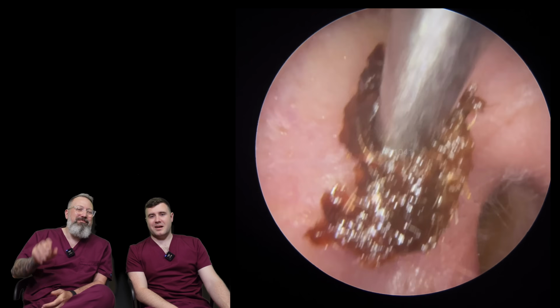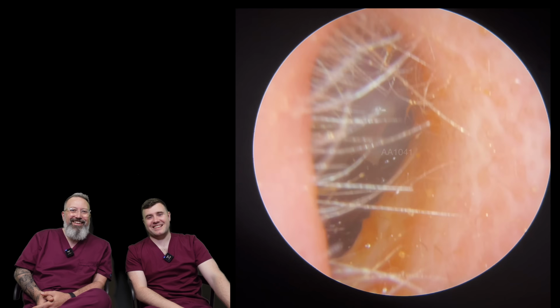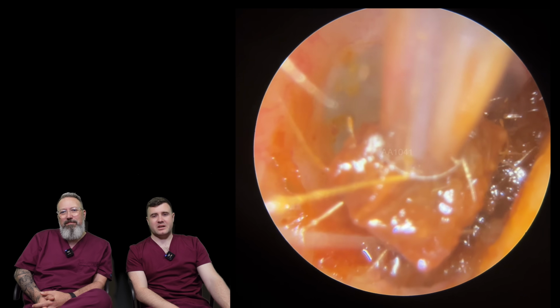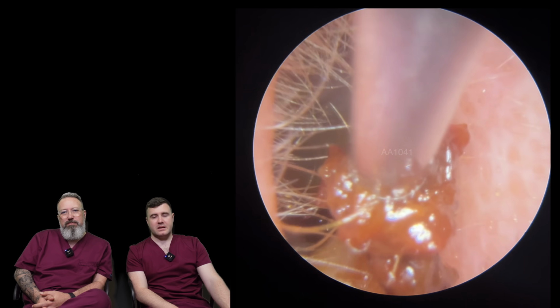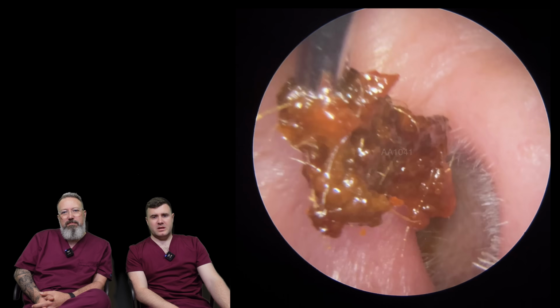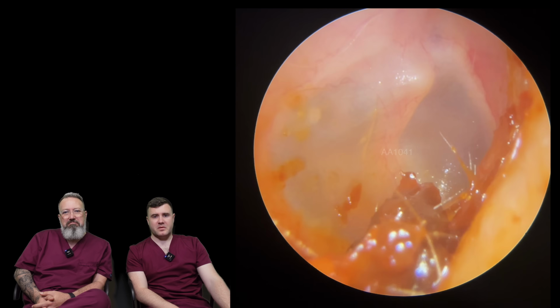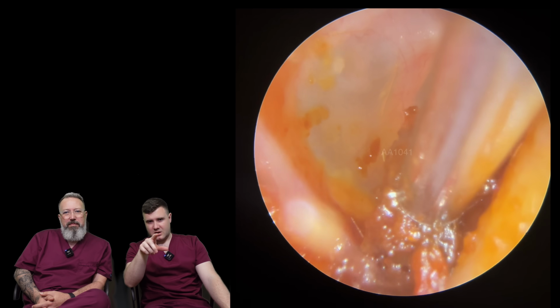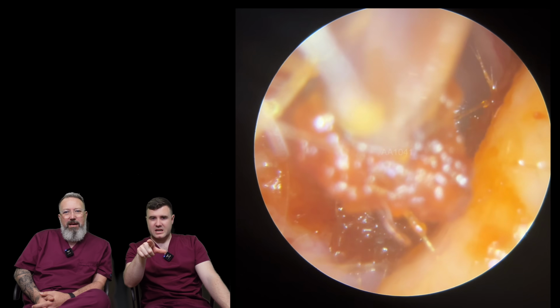The next piece is going to be really deep down there. No, we're okay. Nice and easy. I'll switch to the fine end here now just to get this last little bit away. So it's coming away in decent sized pieces, to be fair. Because the patient has used quite a lot of oil, you will see a lot of staining around the ear canal, which is quite wet.